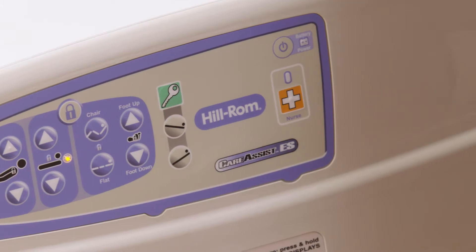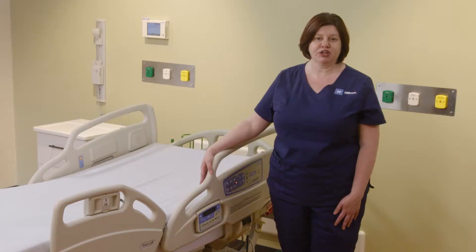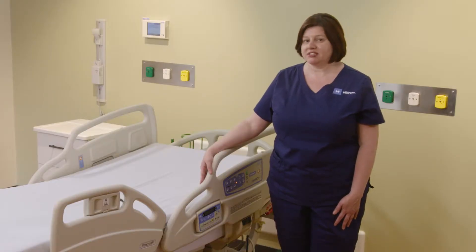Hello. Today I'm going to talk to you about the Care Assist and how it can help you with your daily workflow. I just got a text that we're getting a new patient and we need to prepare the bed.